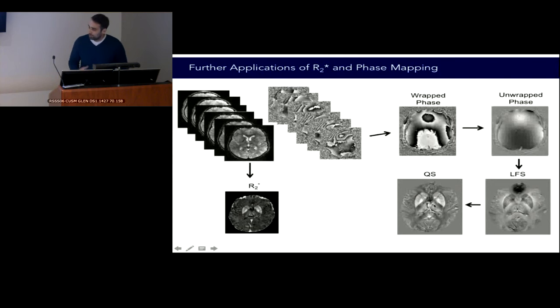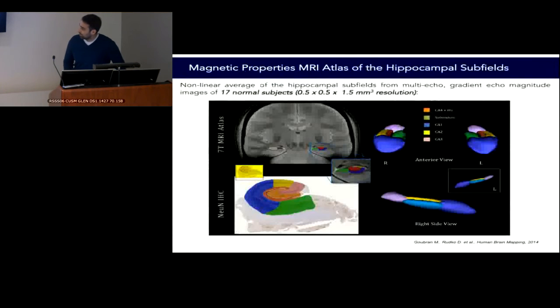Since we developed this software, we wanted to apply it for areas other than MS, and fortunately at Robarts there was a group, Terry Peters and Maged Goubran, as well as Ali Khan, who were interested in looking at the hippocampal subfields in epilepsy. In mesiotemporal sclerosis and epilepsy, the hippocampus atrophies, and surgical planning relies on knowledge of the hippocampus and specifically of the hippocampal subfields in order to determine what type of surgical targeting they perform.